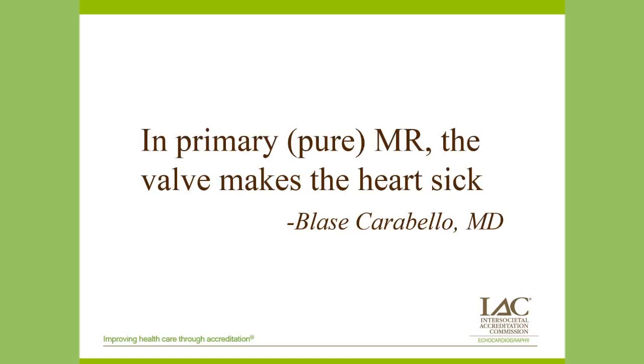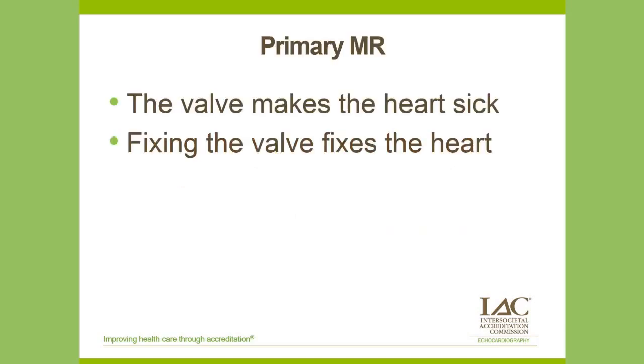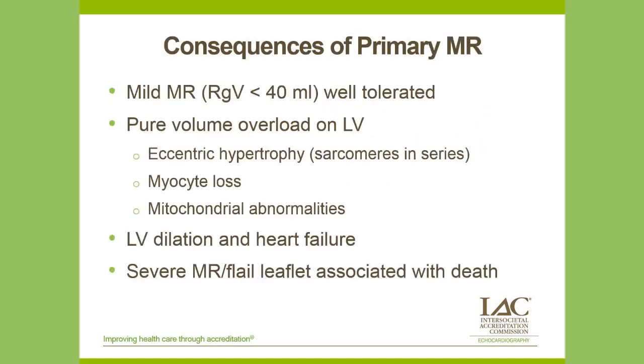So let's go back to primary versus secondary. We're going to start first with primary MR. Blase Carabello, who's been a friend of mine for 30 plus years, famously said, in primary or pure MR, the valve makes the heart sick. And the corollary to that is, if you fix the valve, you fix the heart. So the problem in primary MR is the valve. When you fix it, the heart and the patient get better.